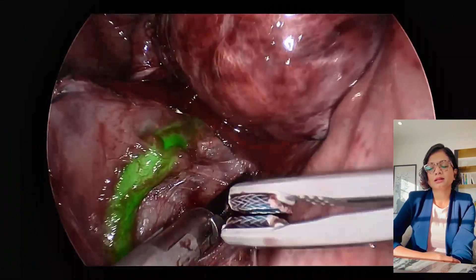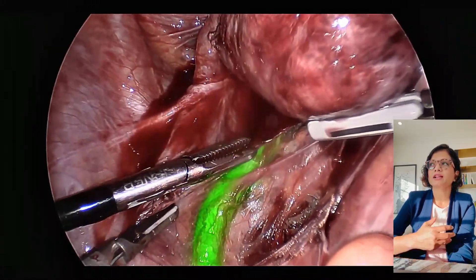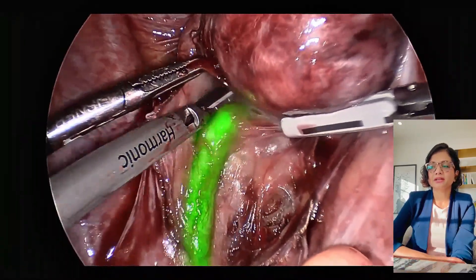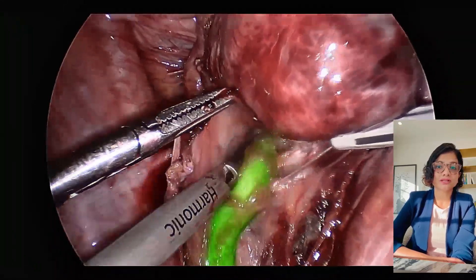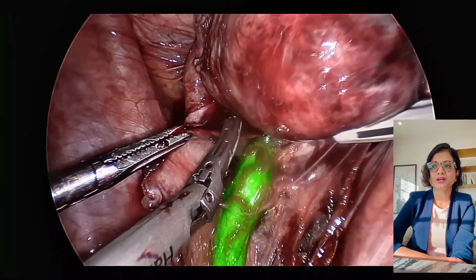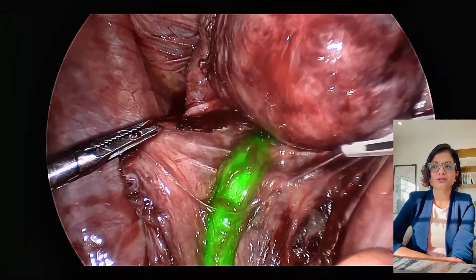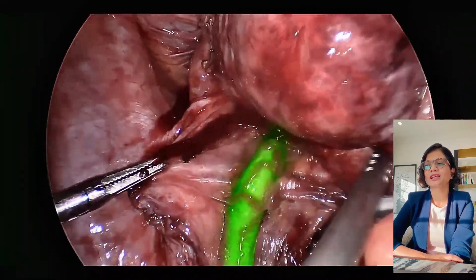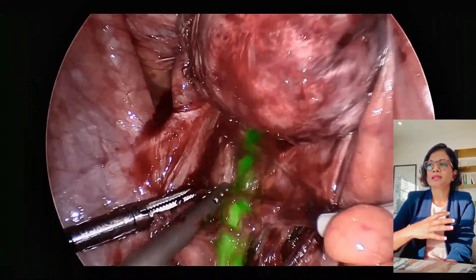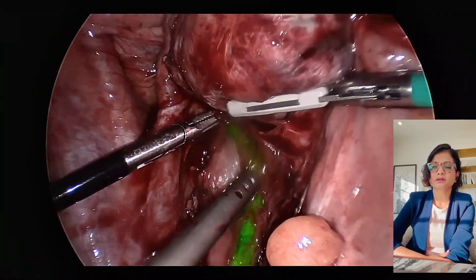With robotic, until now we still have to use the firefly mode where ICG then becomes a bit apparent. Hopefully with the new Da Vinci 5 and the other robotic modalities as well, I believe that they're going to bring ICG in soon in their formats as well. The benefit in laparoscopy is you get to see ICG all the time — you don't have to press a special button for it.